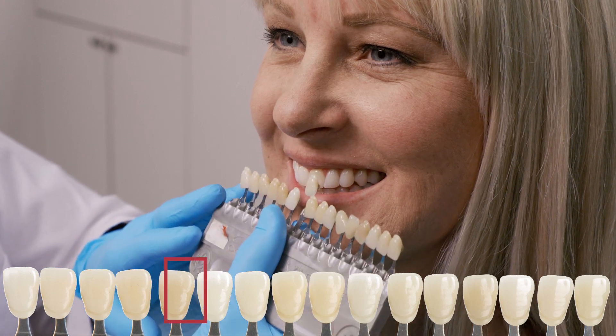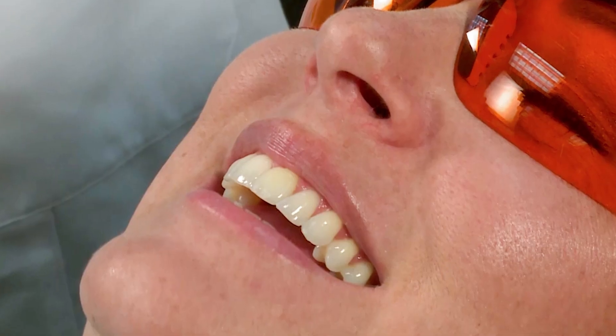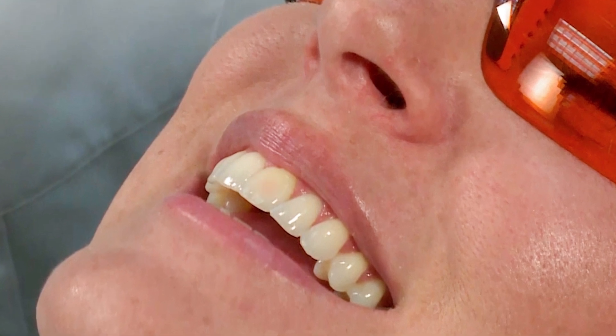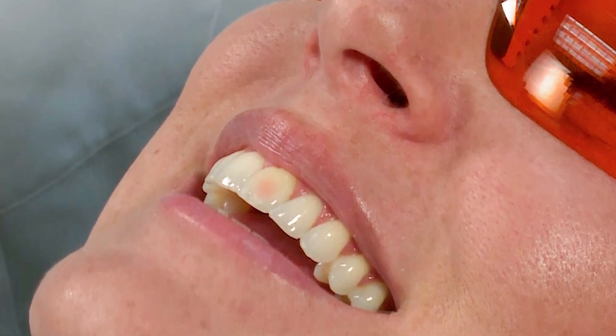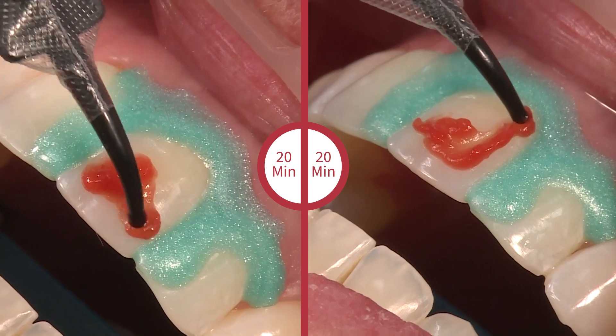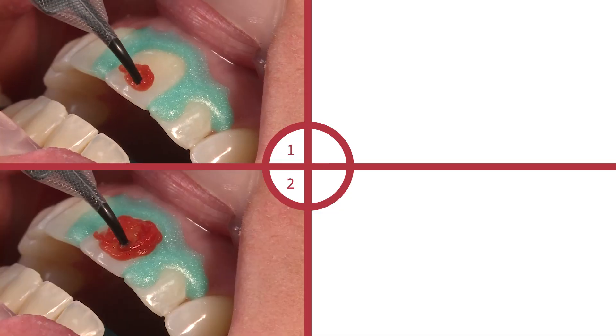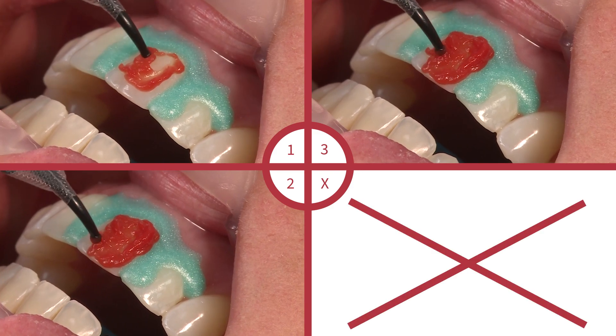Evaluate shade change after each application and monitor the patient for sensitivity and irritation. If persistent tooth sensitivity occurs, discontinue use. Repeat application one to two times or until the desired results are achieved. We do not recommend exceeding three applications per visit.